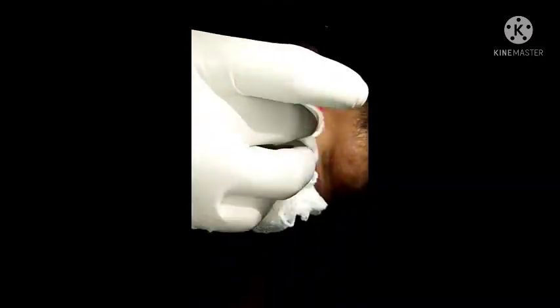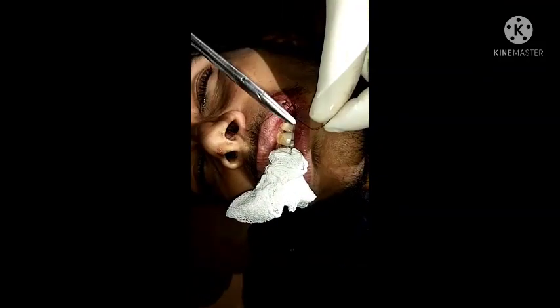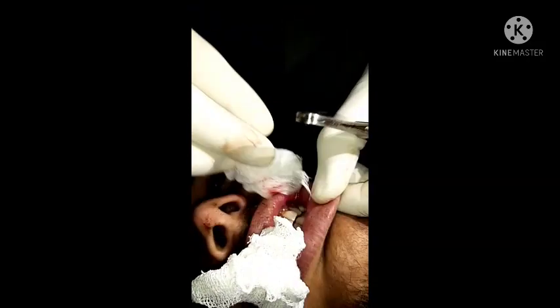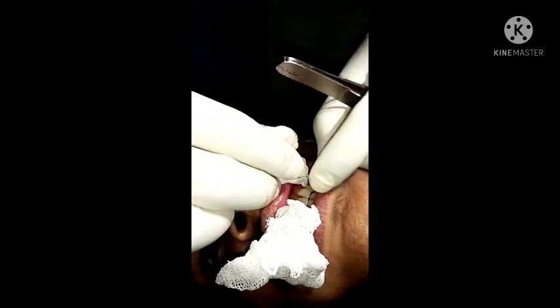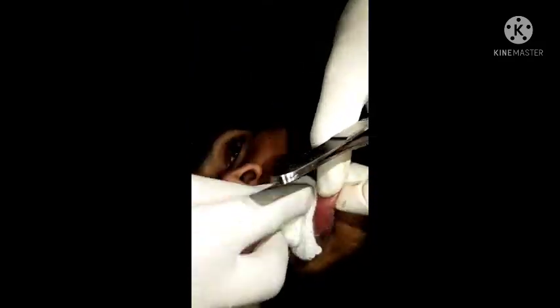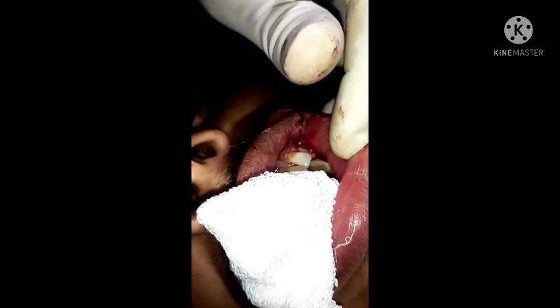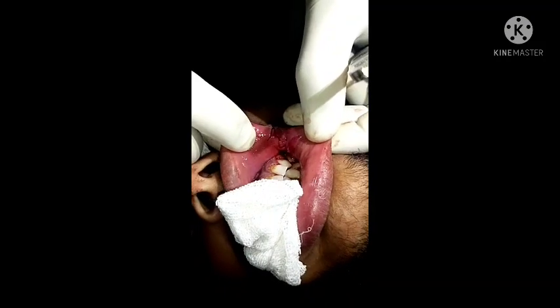You have to mop regularly to prevent bleeding and aspiration. The injury of the lip is also present on the inside, so we have to take one more suture from the inner side of the upper lip. Before suturing, it is necessary to remove the bleeding and blood from the wound, and you have to clean it well to visualize the wound edges. Here you can see this is the inner side of the injury.